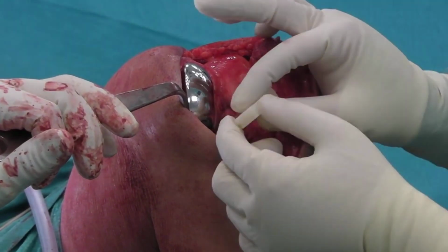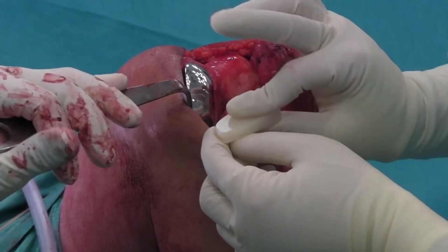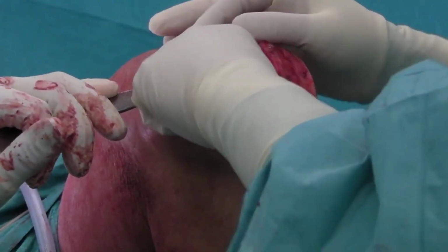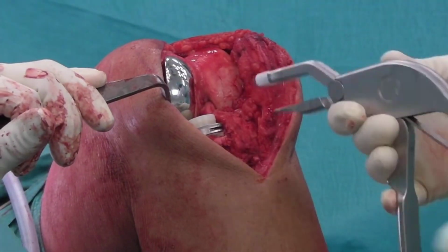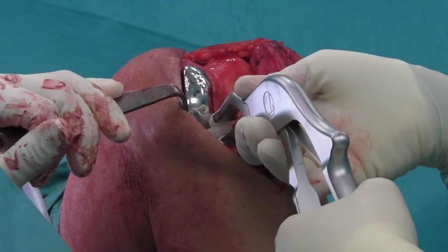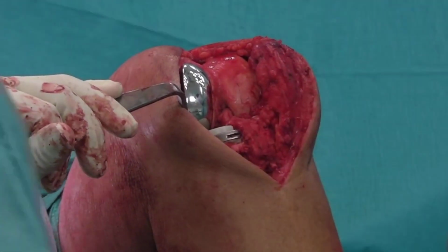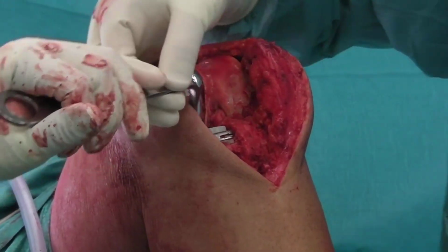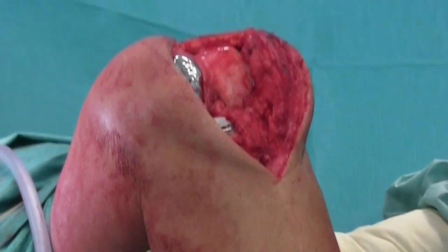After waiting for the cement to harden completely, about 12 or 13 minutes, we insert the final part, made of high molecular weight plastic, called polyethylene, between the metal components of the femur, above, and the tibia, below. This plastic component is extremely resistant and has the important function of recreating the height of the joint, preventing the two metal surfaces from touching each other.